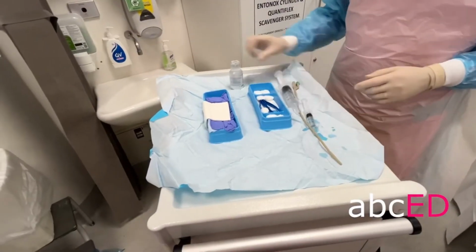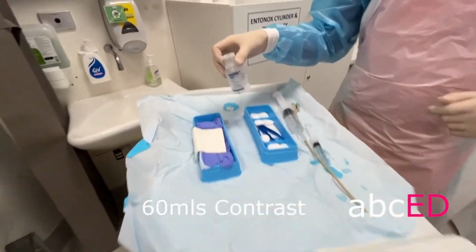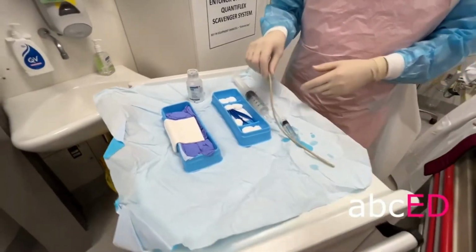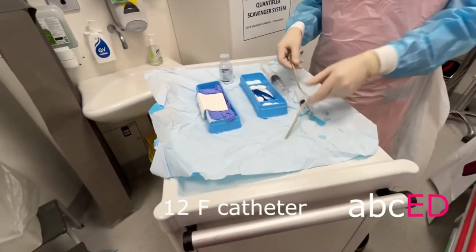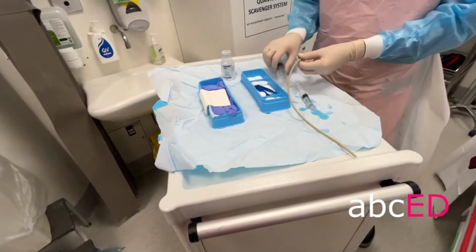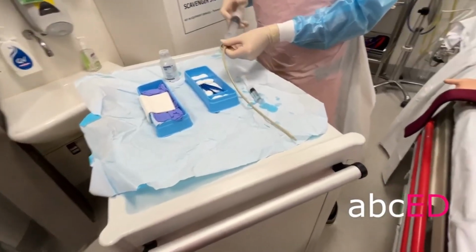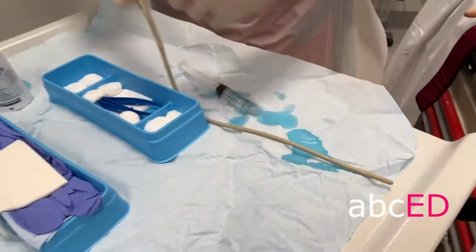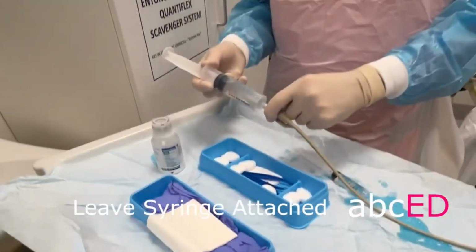Draw up 60 ml of contrast. We use Omnipaque. Use a 12 French catheter and prime it with the contrast so there are no bubbles. Leave the syringe attached.